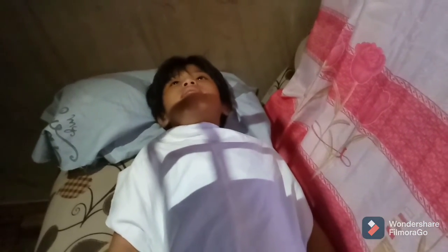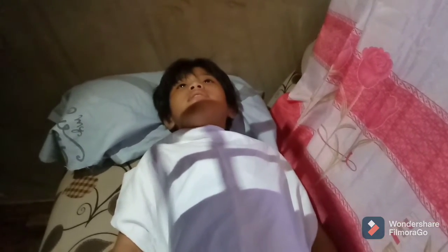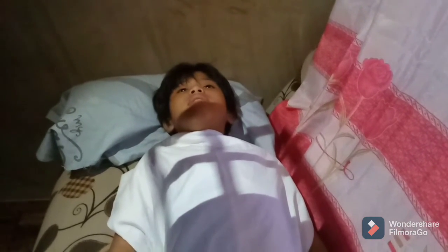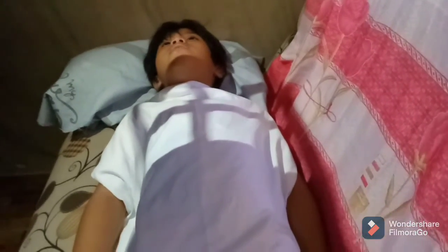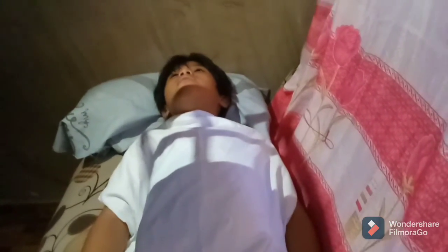Today we are going to demonstrate the AP projection of the chest for a trauma patient, mobile radiography, in a supine and semi-erect position of the patient. The clinical indication for this procedure is to demonstrate pathology involving the lungs, diaphragm, and mediastinum. Determining air-fluid levels or pleural effusions requires a completely erect position with a horizontal central ray, as in the PA or decubitus chest projection.